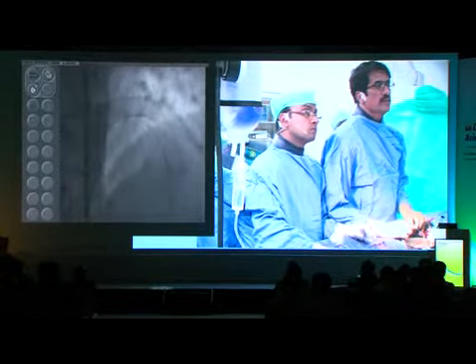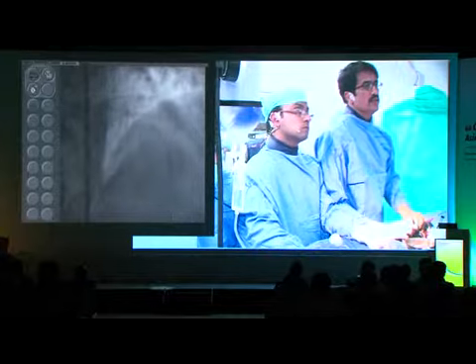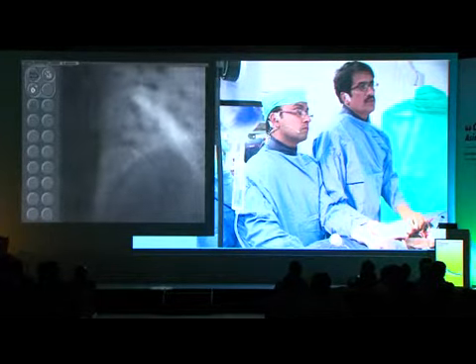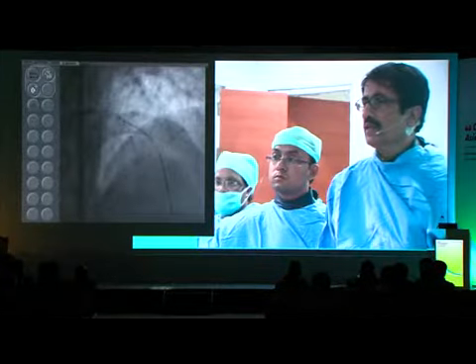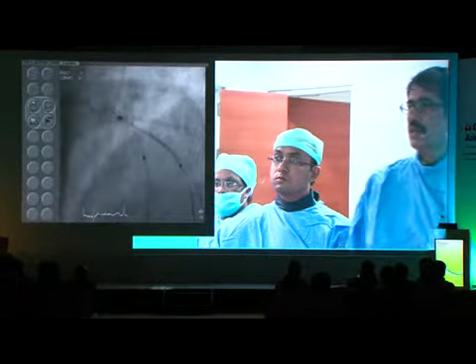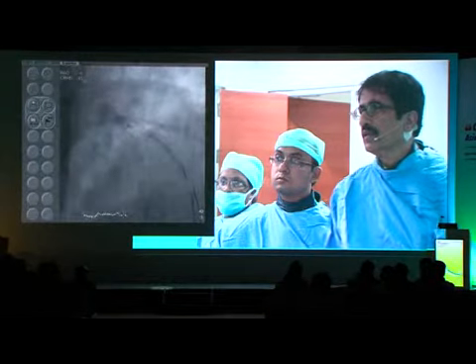I'm going to take a picture and zoom it for you. No contrast. Okay, zoom. Freeze.